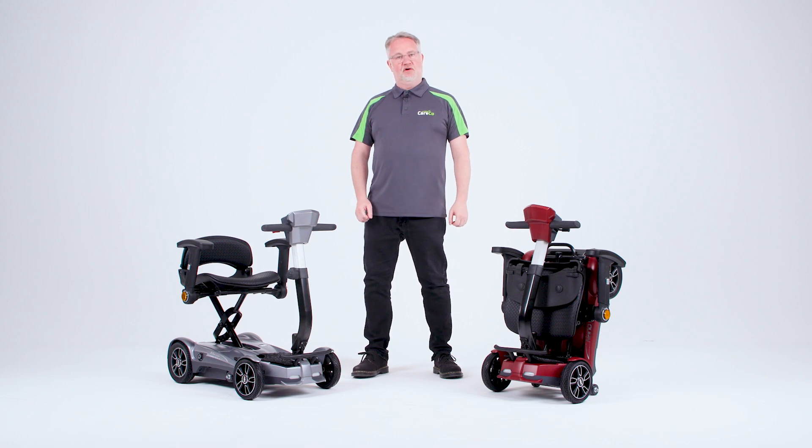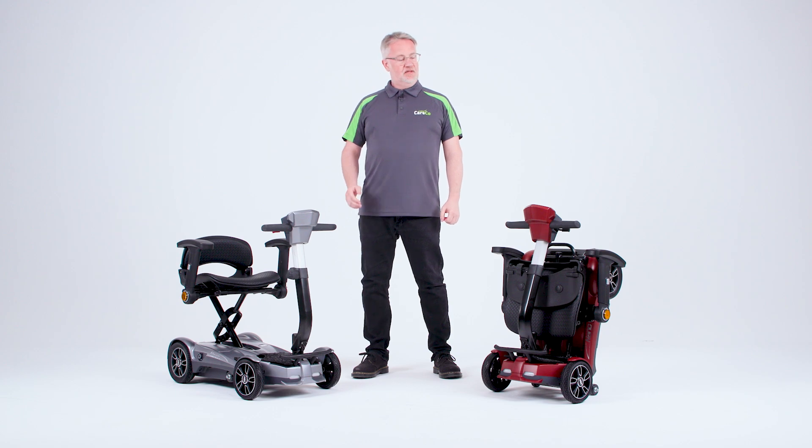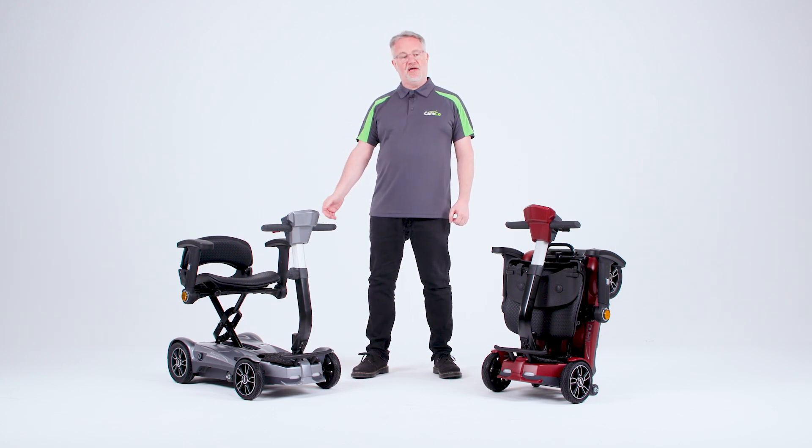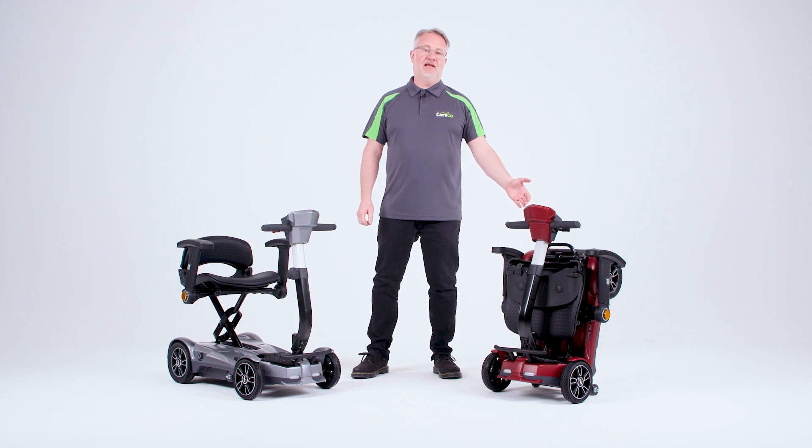Hello, I'm Simon from Careco and here we have the Electric Folding X-Go Nano Mobility Scooter. This comes in two colourways: matte grey here on my right and matte red on my left.